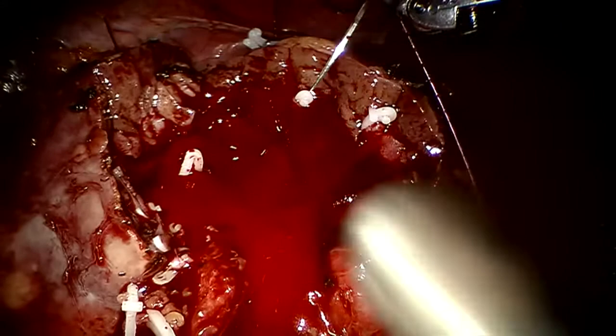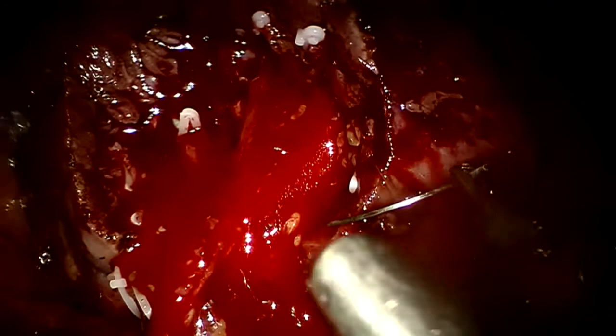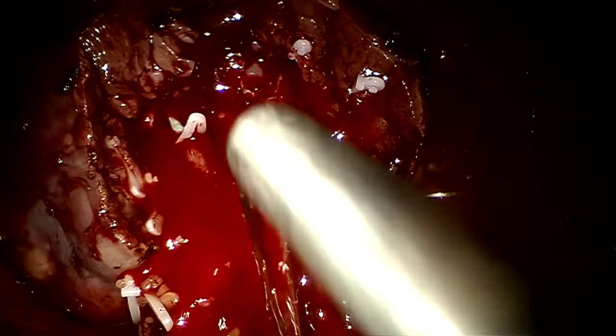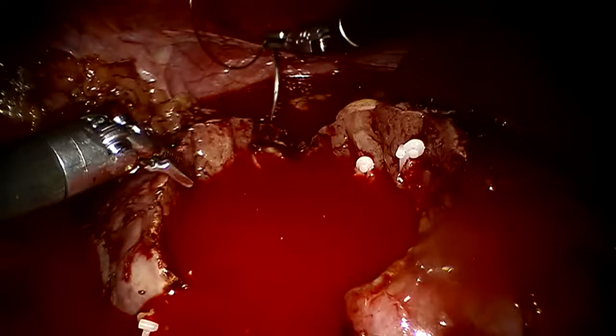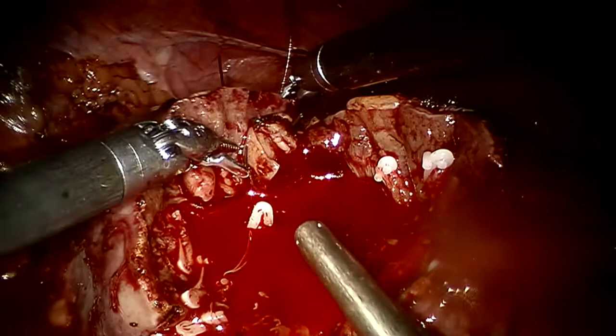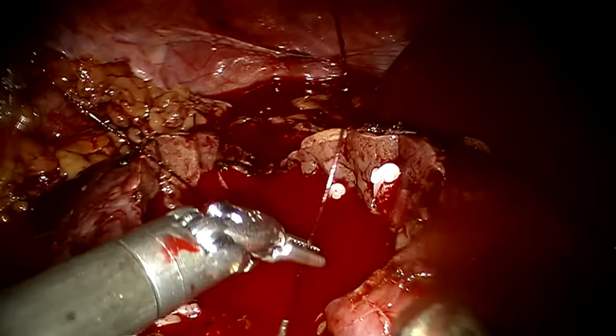Okay, irrigation, please. So now my concern here is any suturing I do, every stitch has the potential to mess up a blood vessel that's underneath. Yet hemostasis is critical. Okay, so we can take that. So that's one area. What else can you identify? So that's really the main spot there. Very good.